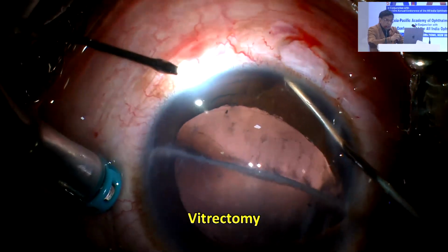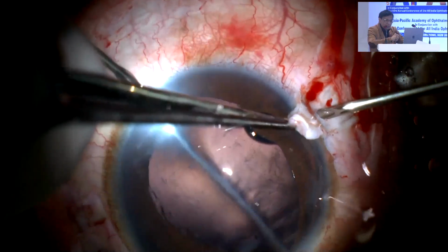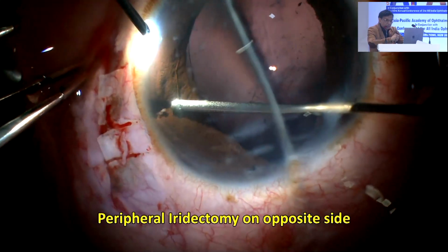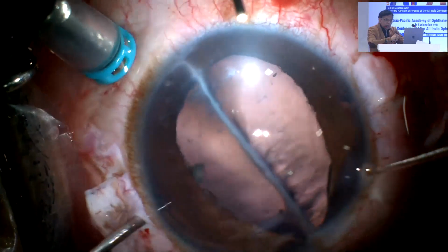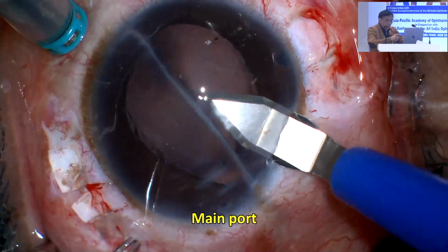But in this case, what I wanted to show you here is, look at the peripheral iridectomy which I'm doing there. Once I have done that, I now go in, make my sclerotomy on either side. Once that's done, I will fix the glued IOL. Here you can see now, I've done the vitrectomy, I've got fluid going inside the eye.